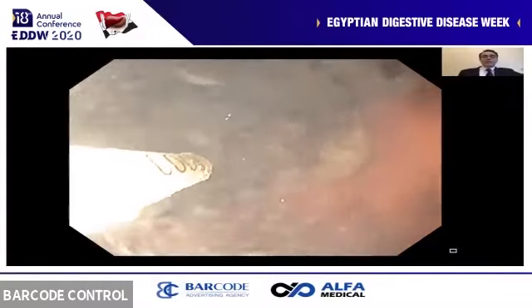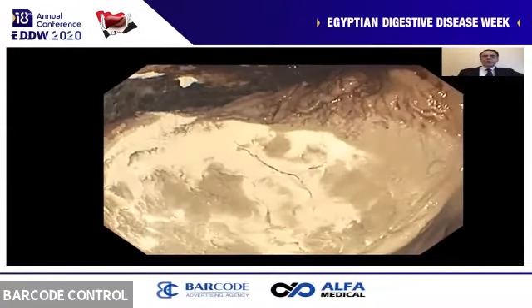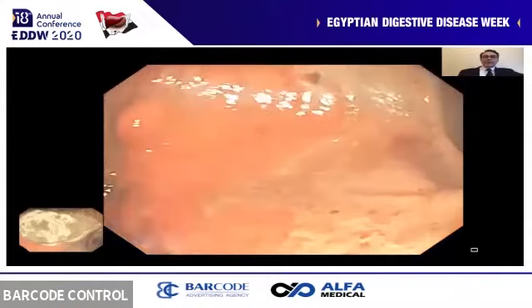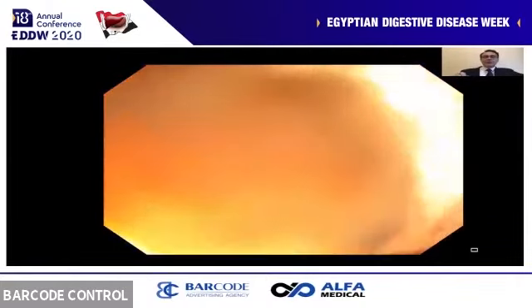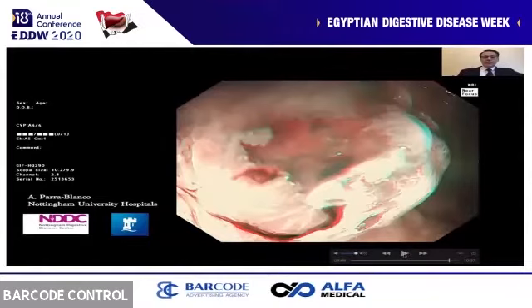So there's no active bleeding, but we completely covered the surface of the ulcer. And we can see it nicely here, how the crust was formed. Of course, there's liquid in the stomach, and it could make the crust last a short time. There's a subepithelial lesion as well, but this resulted in hemostasis. The patient was discharged, and the patient still lived for more weeks, which was something that the family was very happy about.